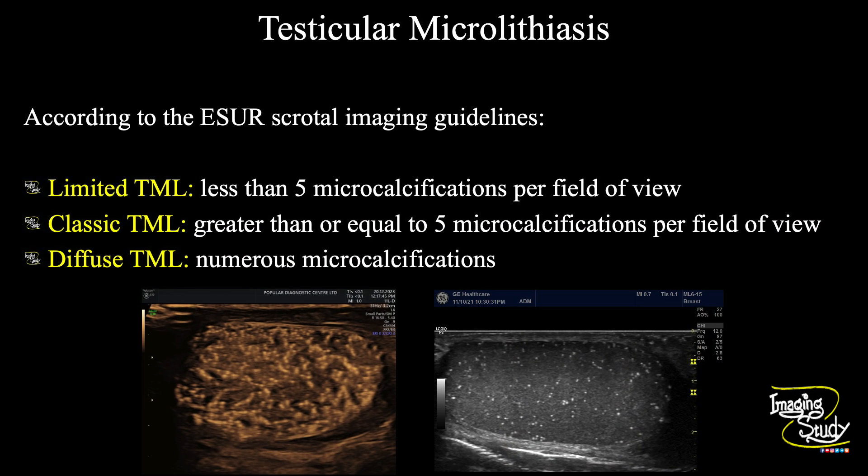We have three different grades or types of testicular microlithiasis. Grade 1, or limited microlithiasis, shows less than 5 microcalcifications per field of view. Grade 2, or classic testicular microlithiasis, shows 5 to 10 microcalcifications per field of view. If it is more than 10, that is diffuse testicular microlithiasis or grade 3.